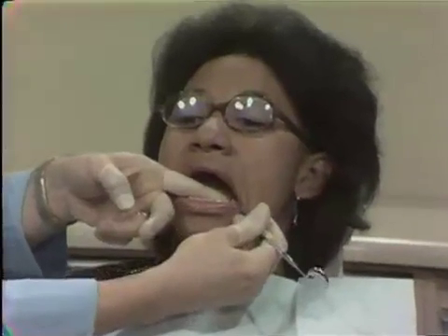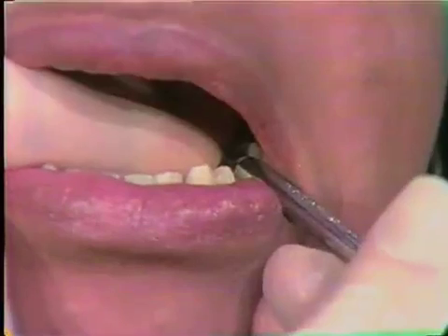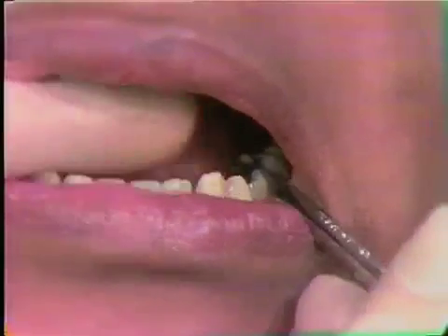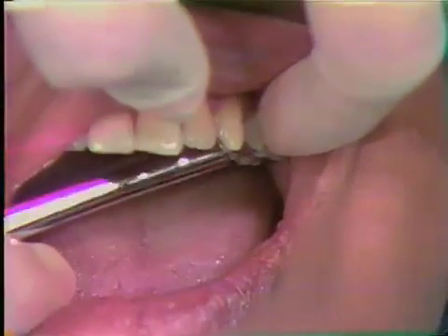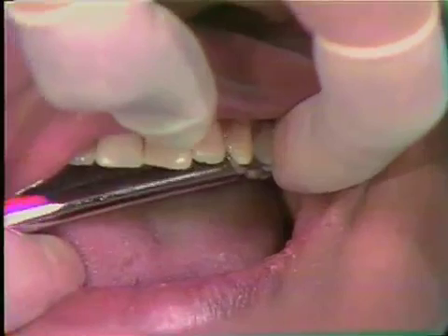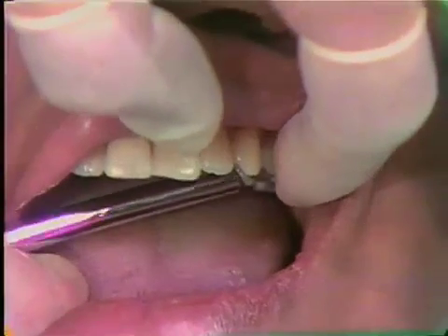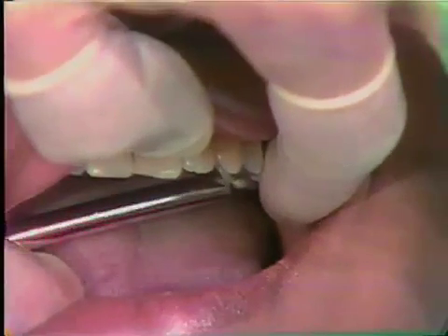When I test the mobility, as we usually do, with the use of a mirror handle and my finger, I'm pushing a little bit on each of the teeth. There is no unusual movement here. Generally there isn't in the area of the appliance, but opposing that, in the upper arch, there generally is. But as I press on the teeth here, there is very little evidence of increased mobility. The same is true for both sides.